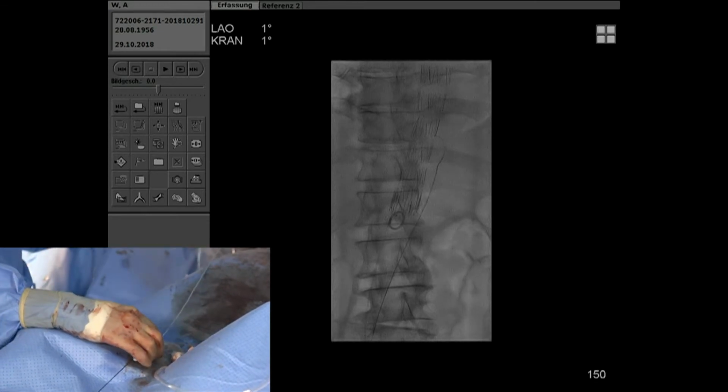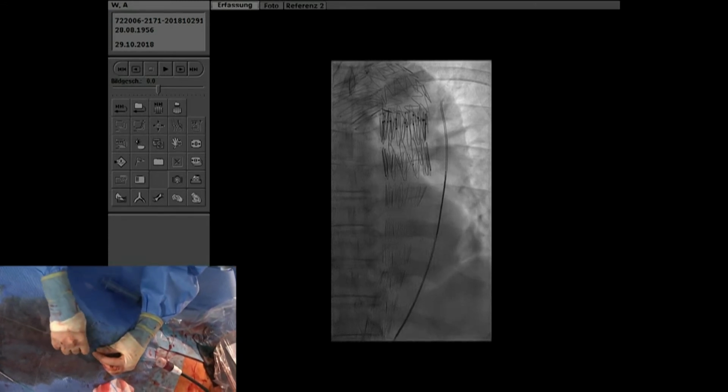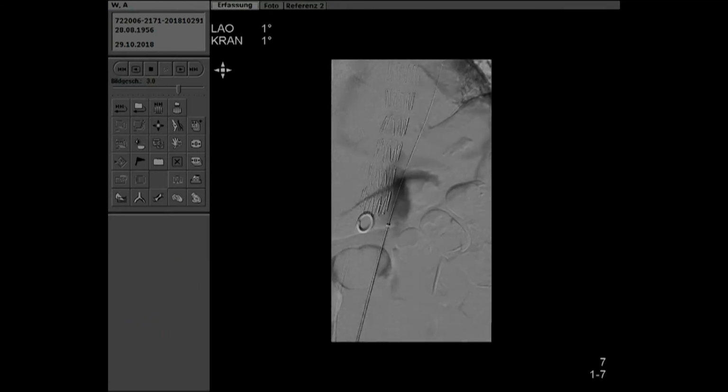We knew from our CT scan that there was a little bit of thrombus, but we were able to access the thrombus also. You will see that shortly in an angiogram. But it's crucial to make sure that the false lumen can accommodate the stiff wire and also the delivery system of the candy plug. But this was possible here, and we advanced the stiff wire here into the false lumen next to the true lumen stent graft, did an angiogram, and here you can see the perfusion and backflow and pressurization also of the false lumen in this angiogram.